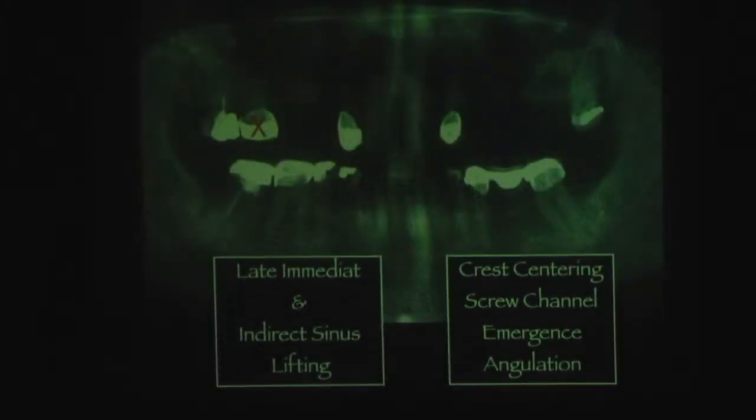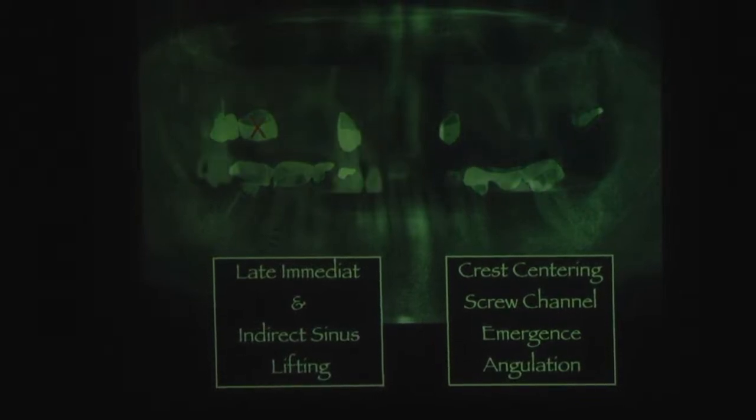So what I did was, on the right side, raise the flap, and on the left side, not raise the flap, only making the punch-out excision. On the right side, we have a late immediate protocol and an indirect sinus lift with some bone augmentation. For the left side, the only things for us are crest centering, screw channel emergence, and angulation. This is the most important part.